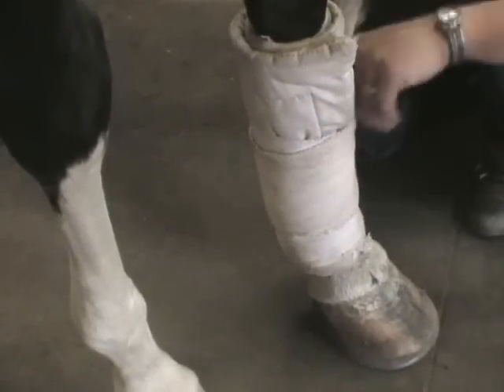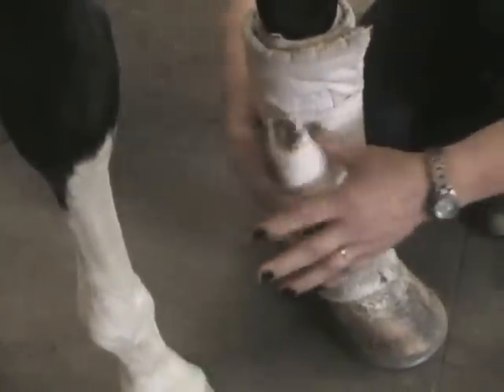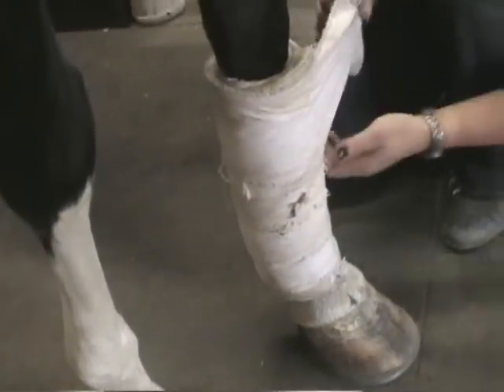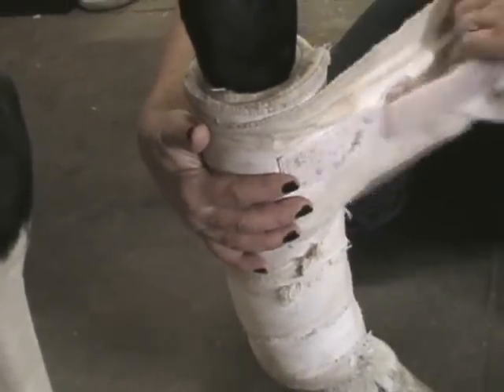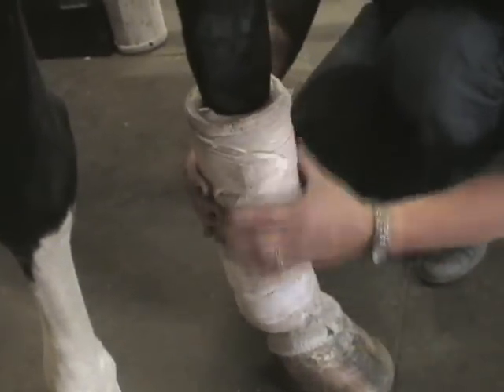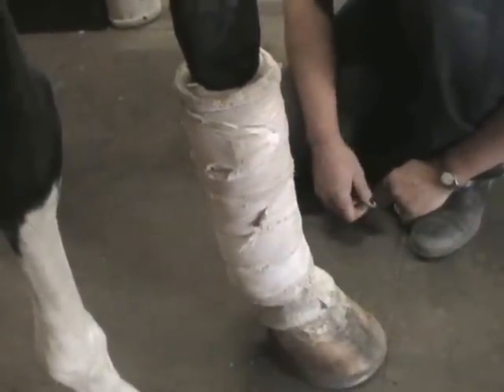The fetlock does have a couple of wraps around, and then the wraps that come up around the cannon and the suspensory are going to be pretty even. Depending on the length of the horse's leg, you may have a couple of wraps around the top too, but it should stop here at the top. It started down here at the fetlock and it's nice and snug. At no time did I twist the leg — I held the leg in place firmly and that will keep her legs nice and tight.